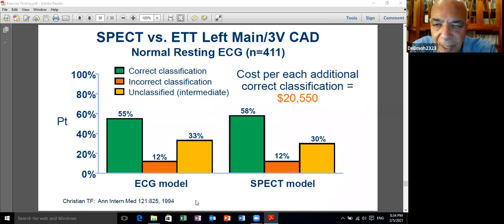الرايت فنتريكل بيبان لما يبقى هايبرتروفي، لكن او انفاركتد يعني في سبيسيفيك باثولوجي، لكن الليفت فنتريكلوجرام هو ده اللي دومينيتنج الالكتروكارديوجرام. So if you get a left bundle you get marked the repolarization changes, marked abnormality in repolarization in the main chamber which is being imaged so to speak by the electrocardiogram.